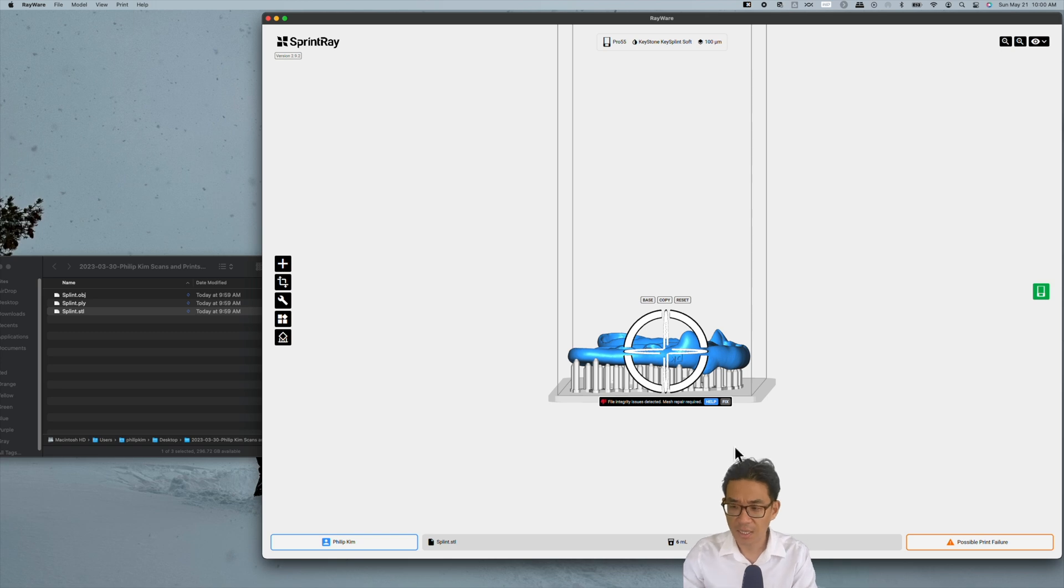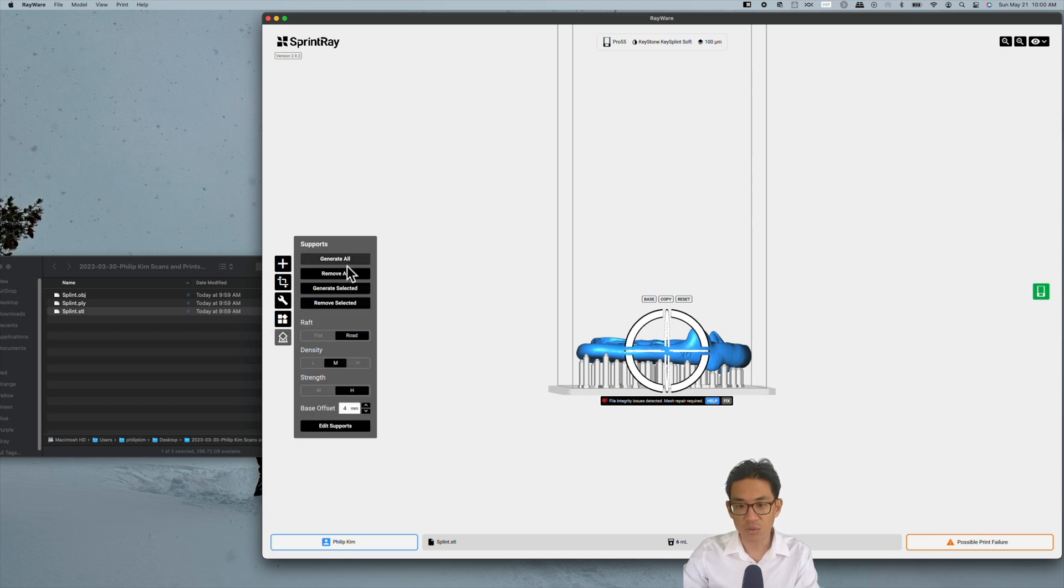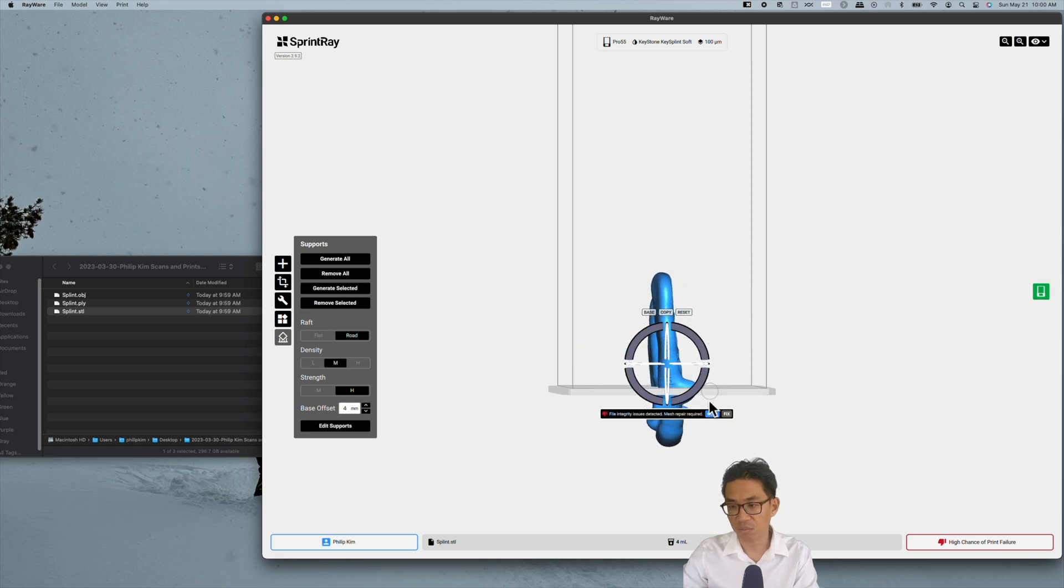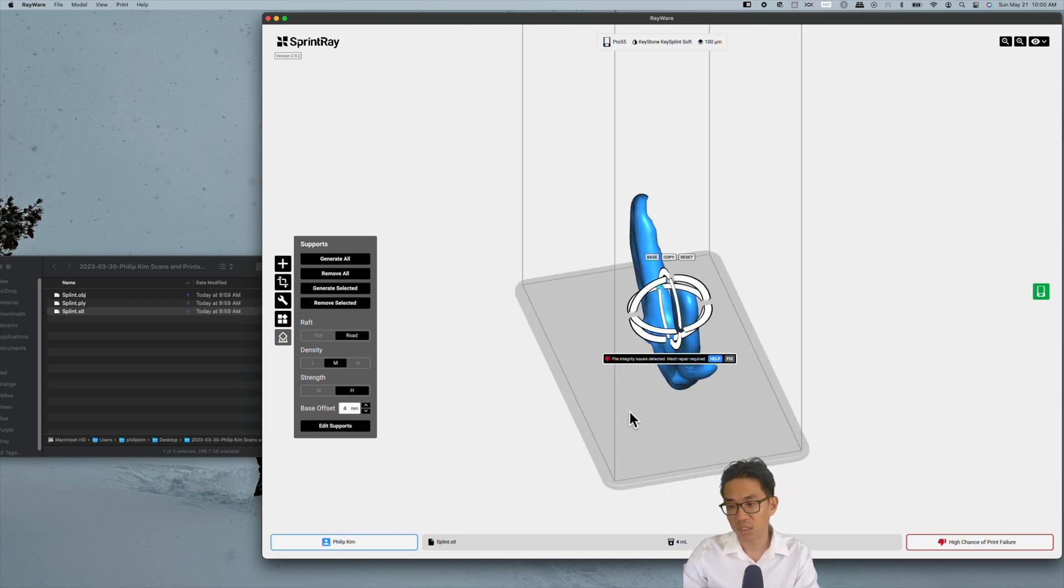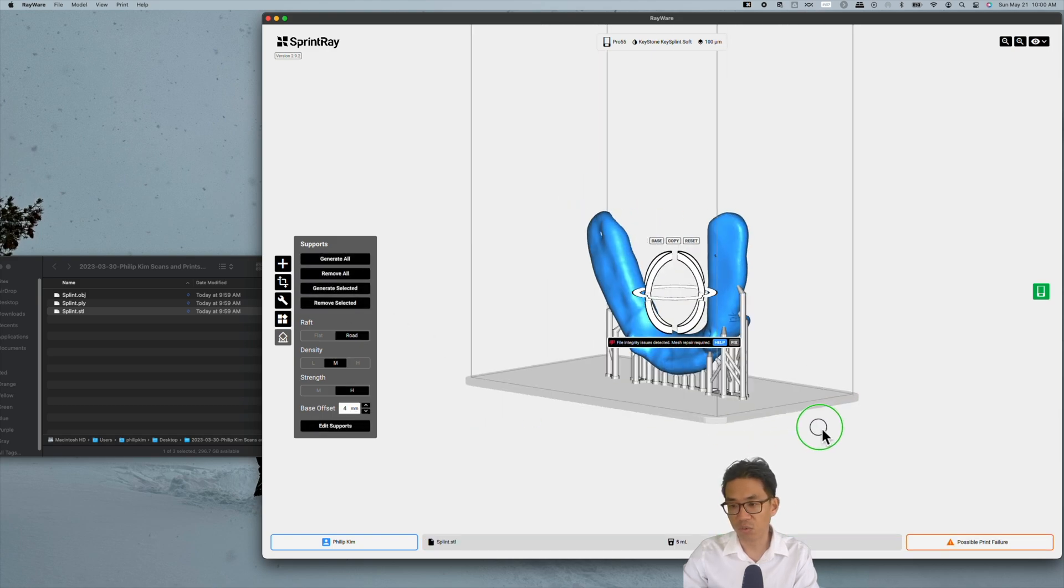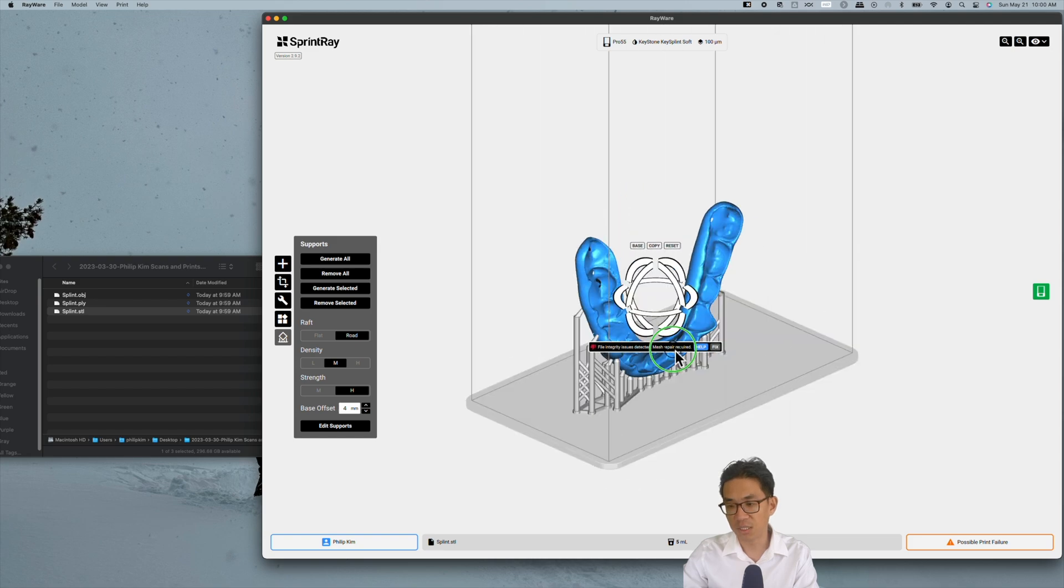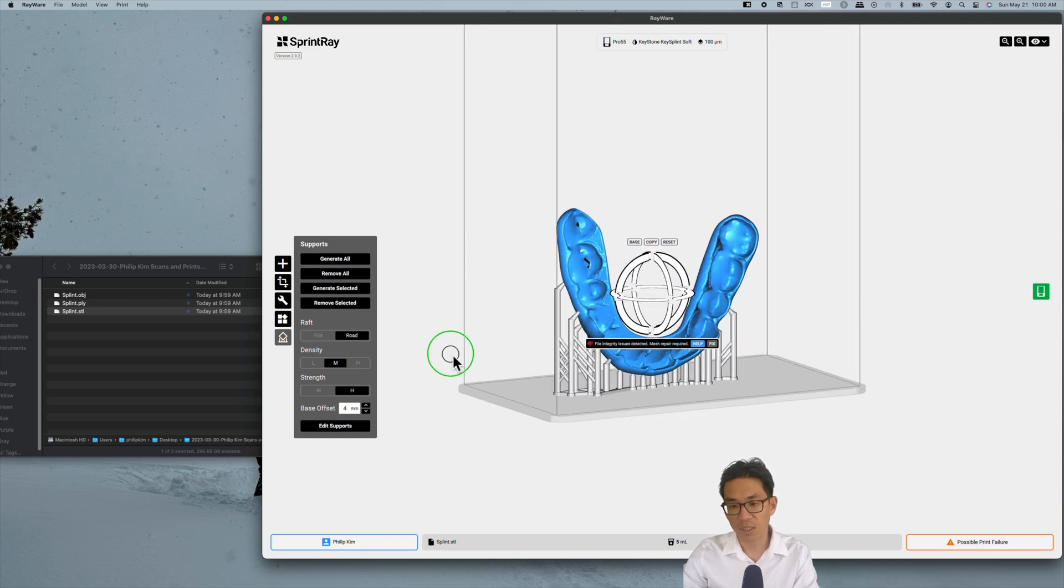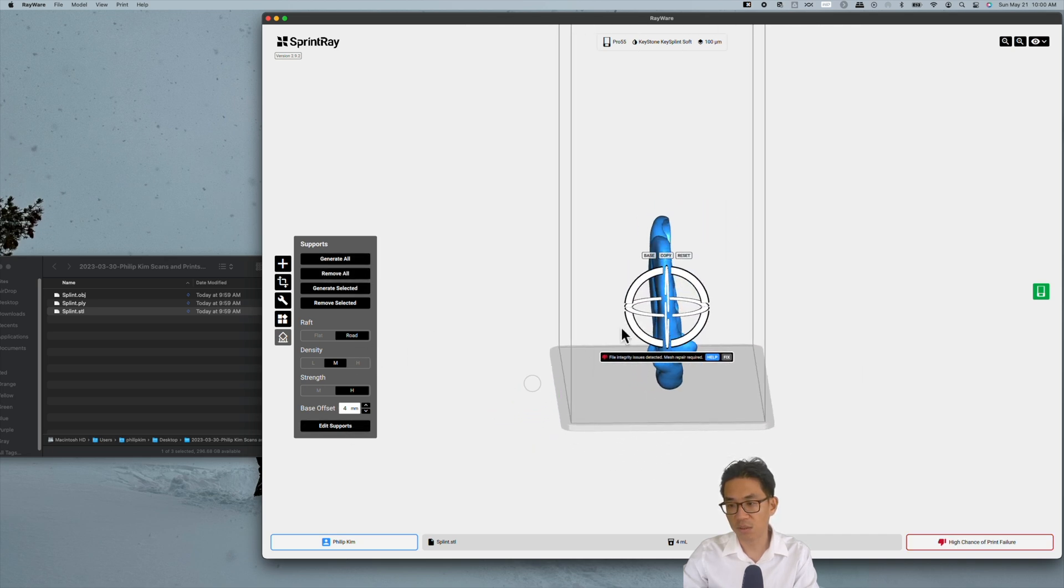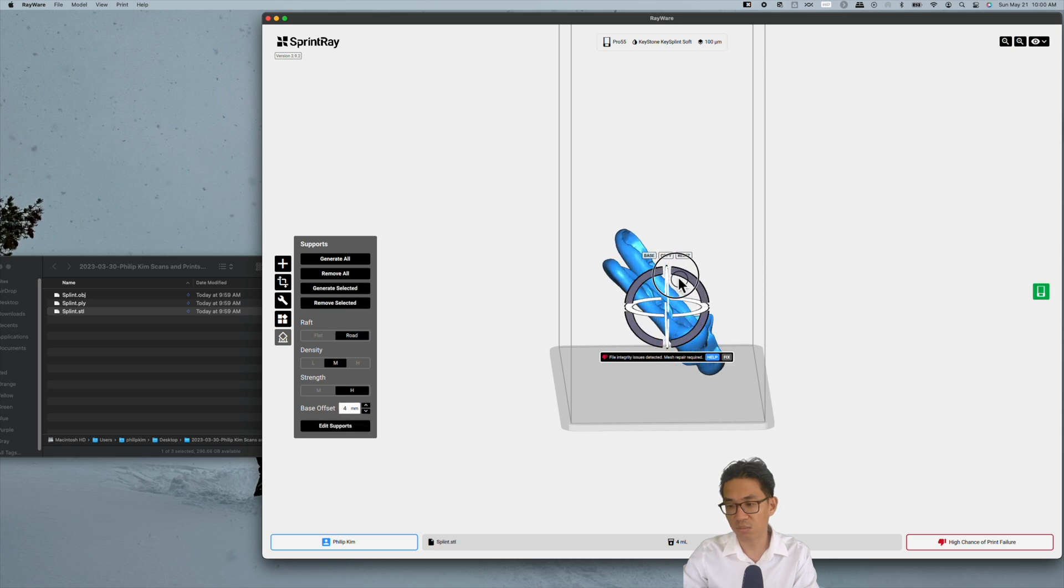The other option would be on the opposite end of that spectrum, to print completely vertical. You get fewer supports and fewer on the occlusal. However, in this case what I would recommend is for printing night guards, the recommendation I'm seeing online is to print at 45 degrees. This is 90, so you want to go halfway between flat and 90.